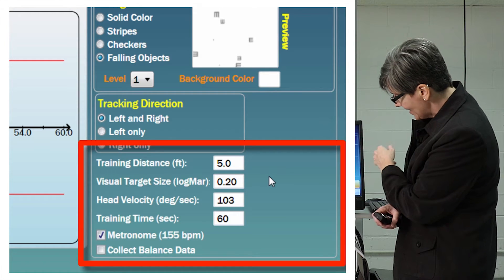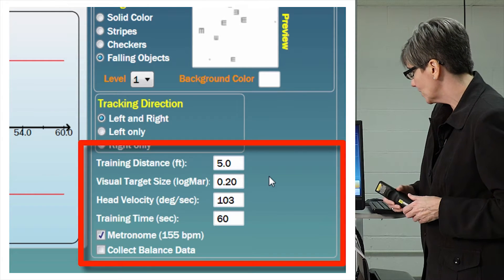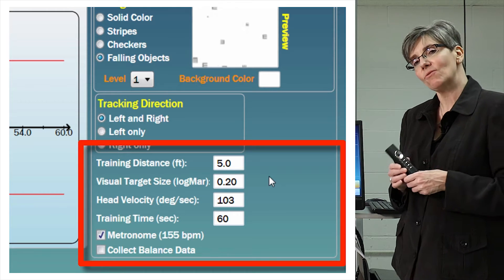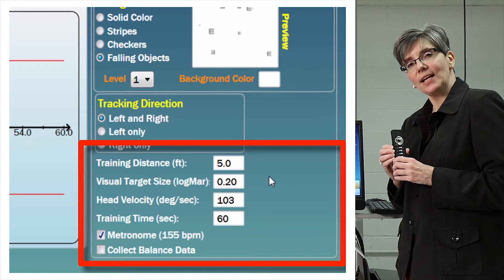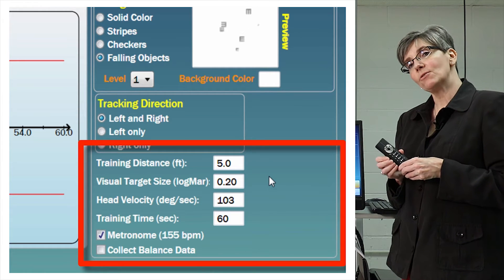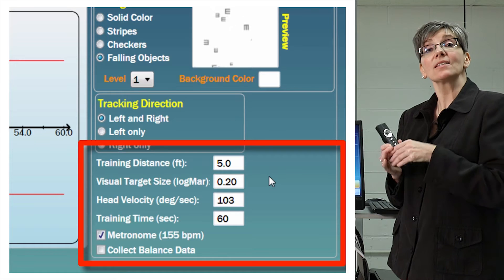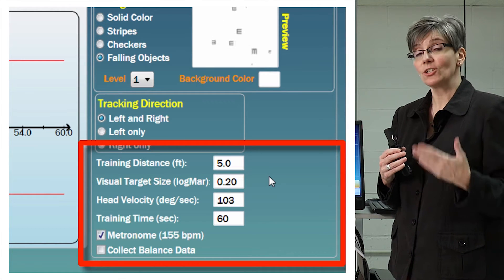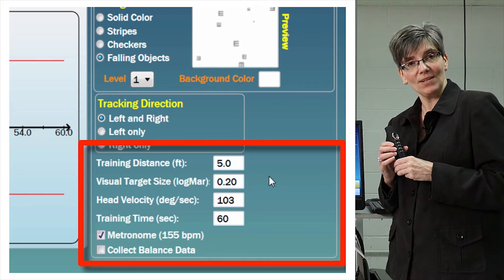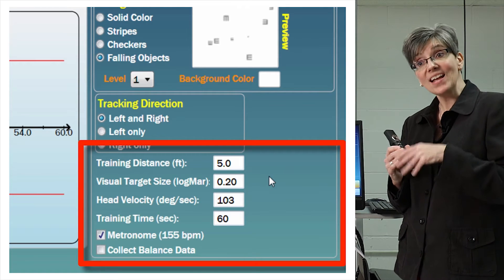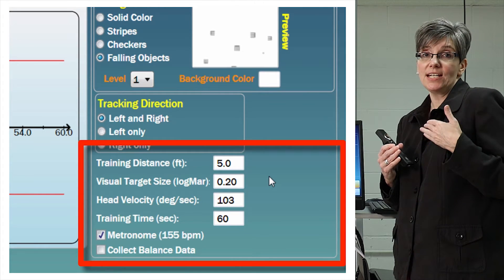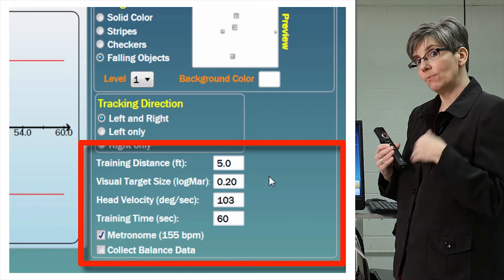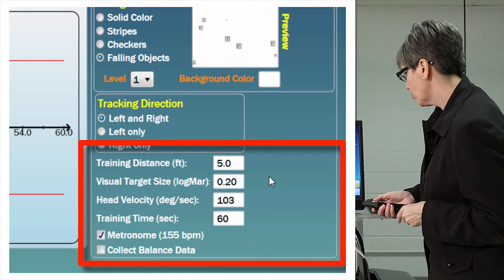The target size is set at 0.2 logMAR and her head velocity is 103 degrees per second. Why 103? Because when turning her head to the left, she could only see correctly up to 103 degrees per second. That's the point at which she's experiencing retinal slip, and that is the point at which I need to start her training.